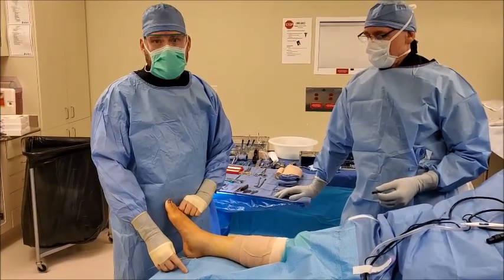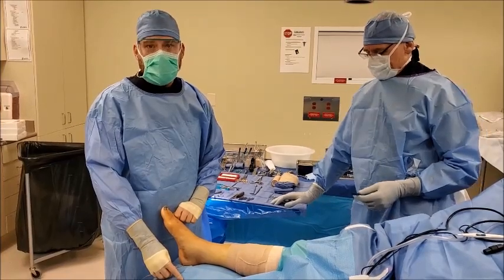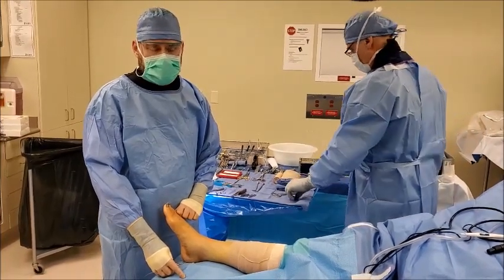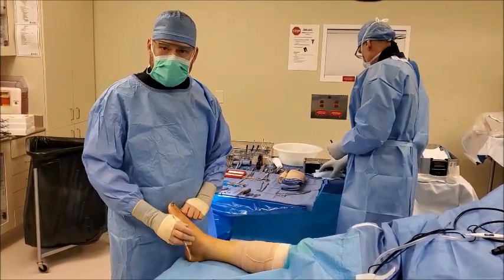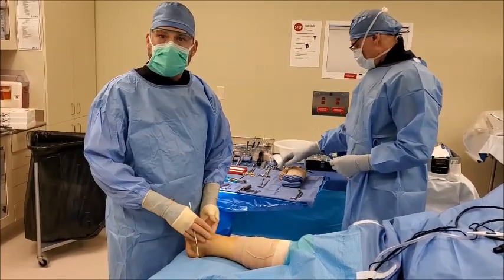This is Dr. Paul Steinke with Foot and Ankle Associates of North Texas. Today we'll be discussing a repair of a tri-malleolar ankle fracture. What that means is this patient broke three of the major bones within her ankle. We'll be using plates and screws to repair those.